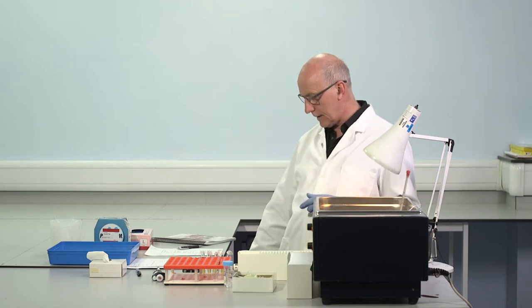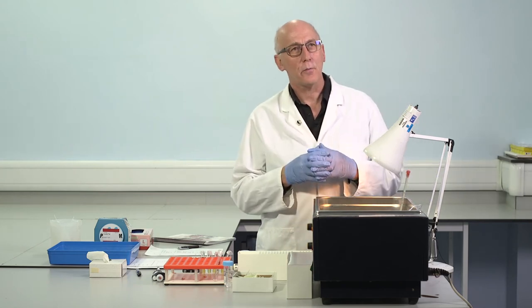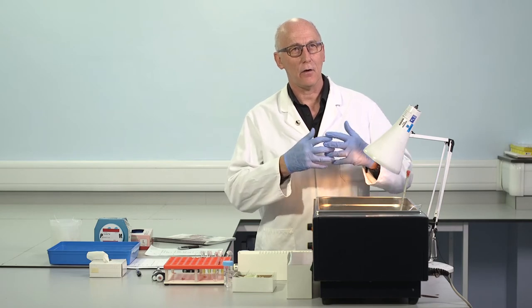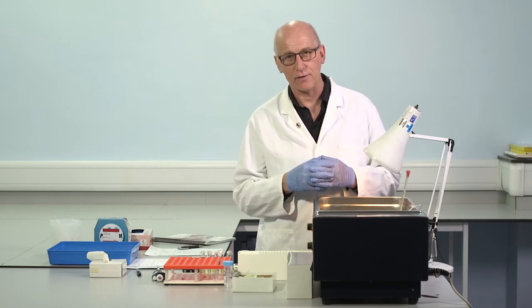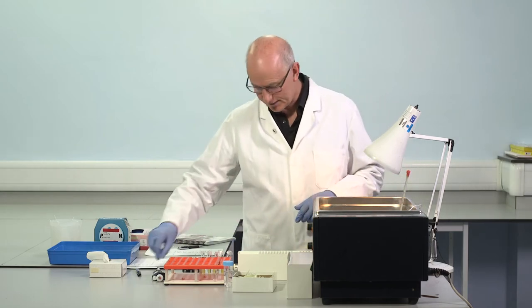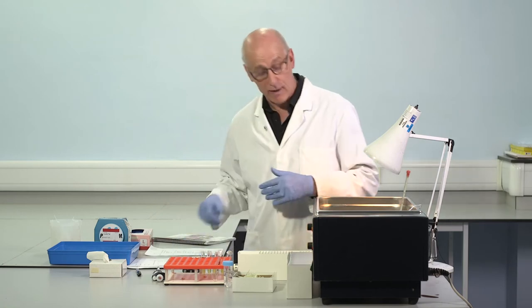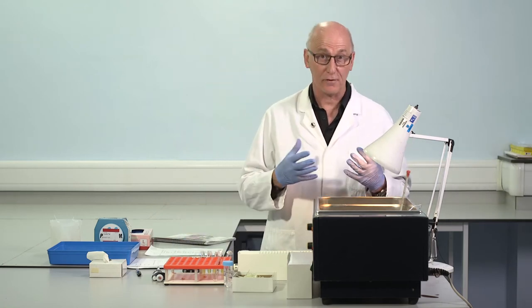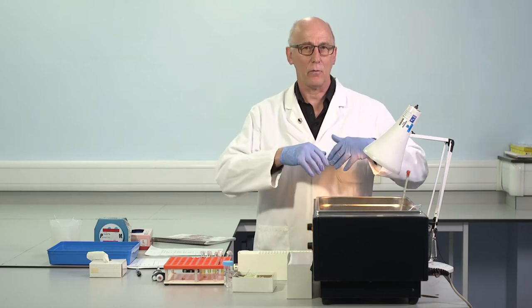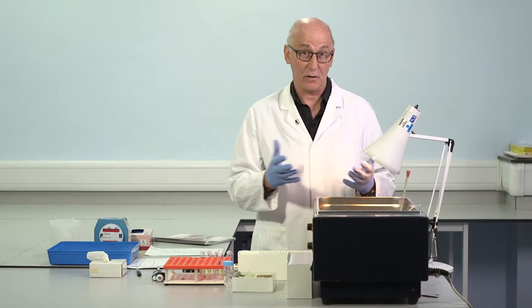And when we did this in the lab, this is done by repeatedly testing on different occasions the same control material. We obtained a range between 35 and 46 seconds. So that's our target range. So the first question we got, 44, is it inside that range? Yes. So we've established that the reagents and water bath is working as expected.